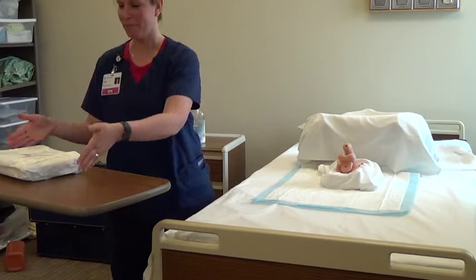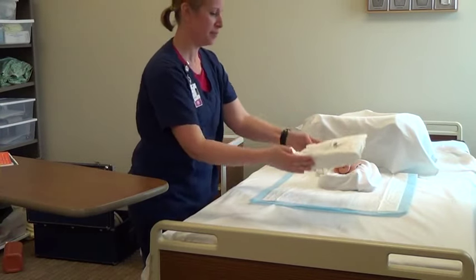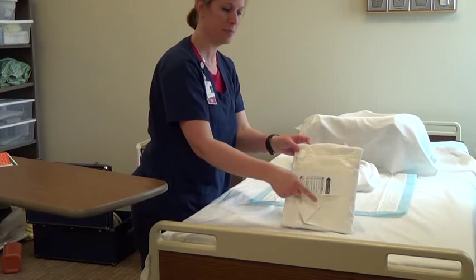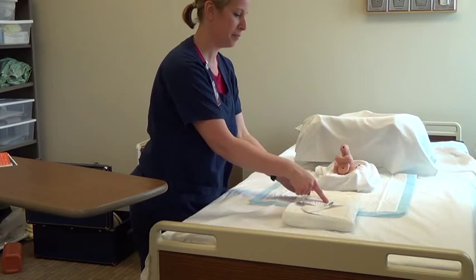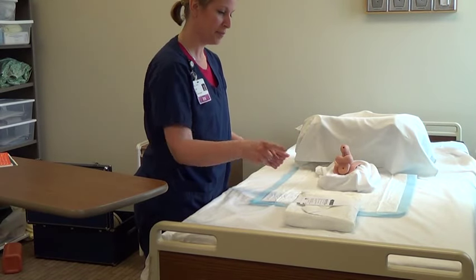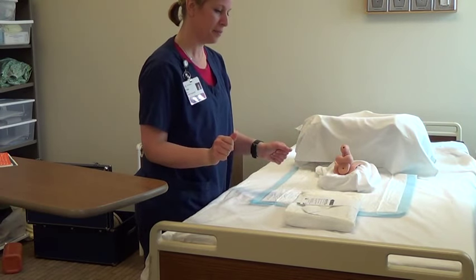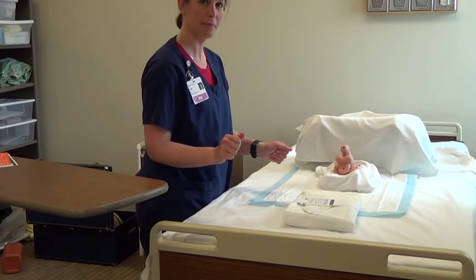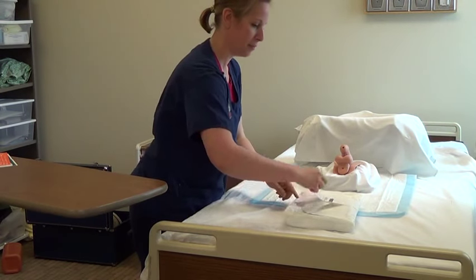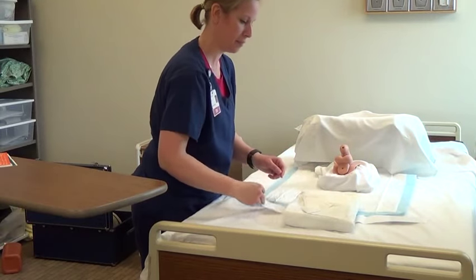Place the Foley kit in between the patient's legs. Position the tray so that the arrow is pointing toward the insertion site. For right-handed individuals, position the tray so that the arrow is pointed toward the insertion site. Please keep in mind that this will be reversed for left-handed inserters. Remove the band by lifting near the adhesive and unfolding the outer wrapper.